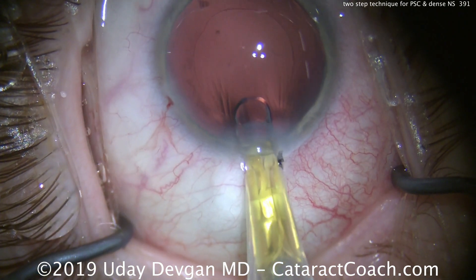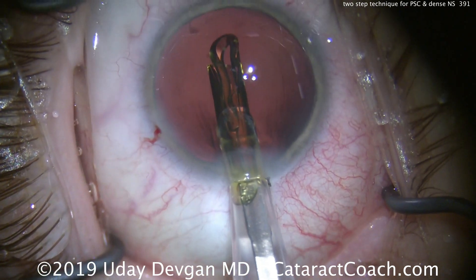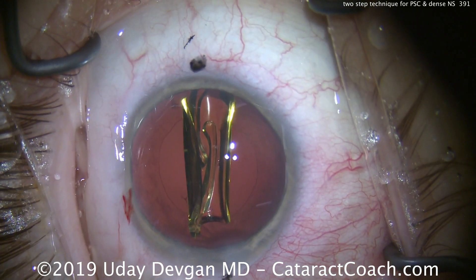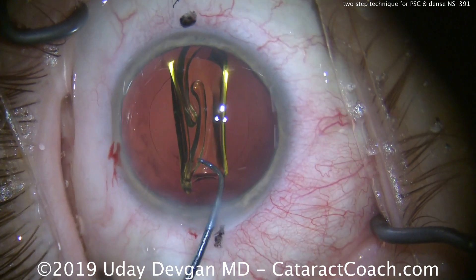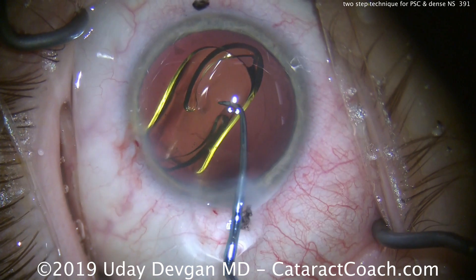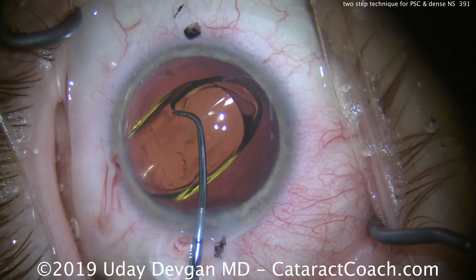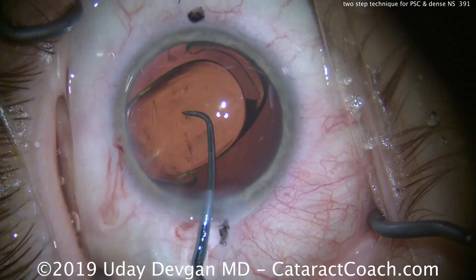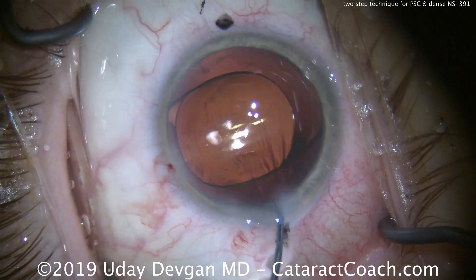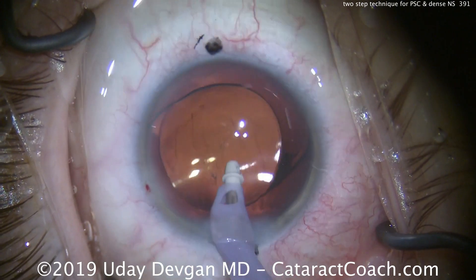Here comes our lens — a single-piece acrylic lens going into the eye. This patient is aiming for residual myopia for the outcome because he wants great near vision. The lens is delivered nicely into the capsular bag. A chopper is used to position it and we rotate until the haptics are in the desired position. You can see the overlap of the capsulorhexis, and we'll have this lined up perfectly at the end of the case.